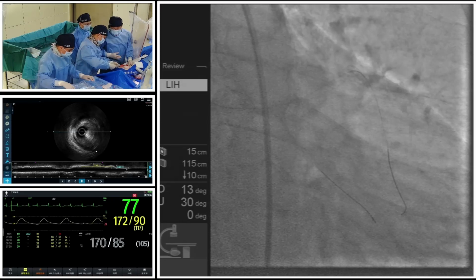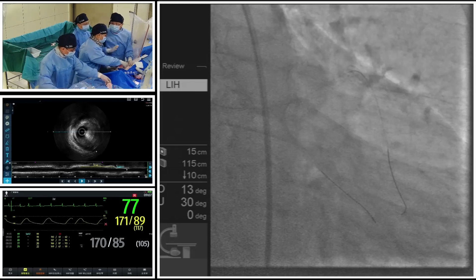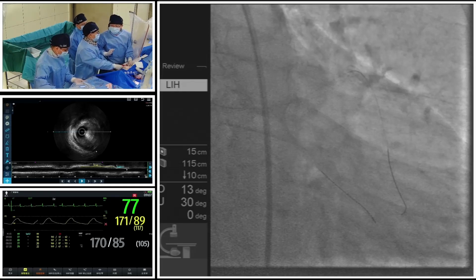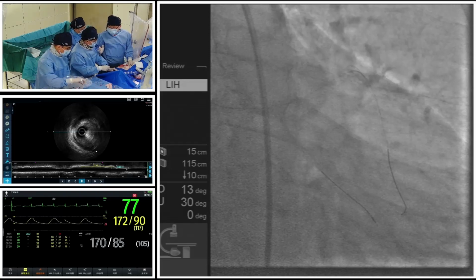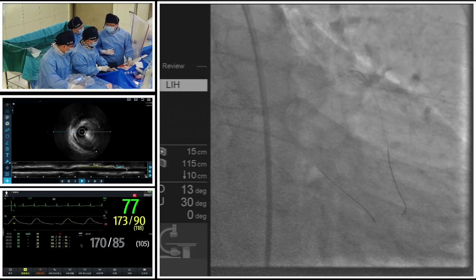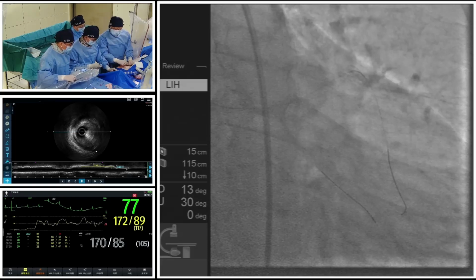If we don't use the dual lumen catheter technique, sometimes if the left main stent is not apposed to the left main vessel wall very well, the wire may go outside of the stent, between the stent and the vessel wall, and after we advance the balloon or other apparatus, it may cause a stent deformation. This is a complication we should try to avoid.